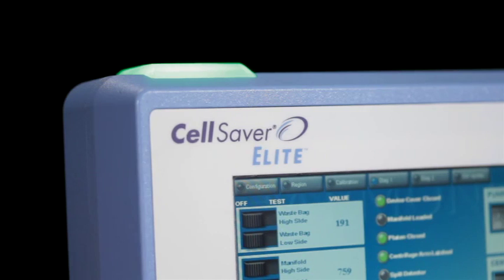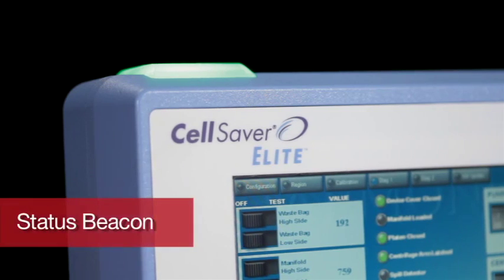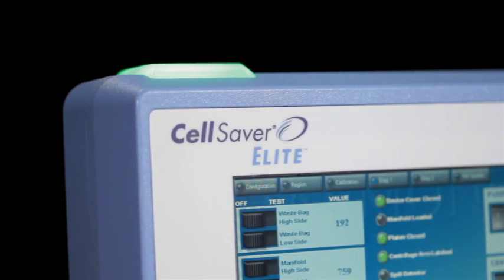On the top of the touchscreen is a status beacon, which will glow green, yellow, or red, indicating that the procedure is going well, attention is needed, or the procedure has been stopped.